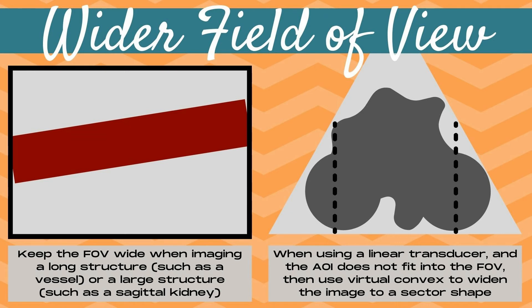When using a linear transducer, such as during a breast ultrasound, if the area of interest — for example, a breast mass — does not fit into the field of view, you can use the virtual convex button to widen the field of view to a sector shape so that more of the large mass fits into the image. On the image to the right, you'll note the black dotted lines, which mark the edge of the field of view in its linear shape. When the virtual convex button is pushed, the field of view is extended and more of the mass is visualized. When possible, try to show a strip of normal tissue on each side of the mass.